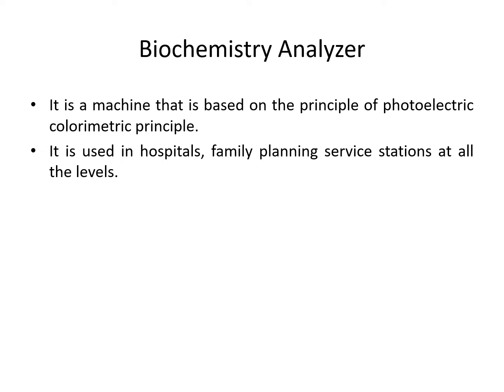See, biochemistry analyzer. What is the meaning of analyzer? Analyzer means which will analyze. And what will it analyze? It will analyze our parameters. Like it will analyze sugar, or it will analyze LFT or RFT. So biochemical parameters are analyzed by a biochemistry analyzer.